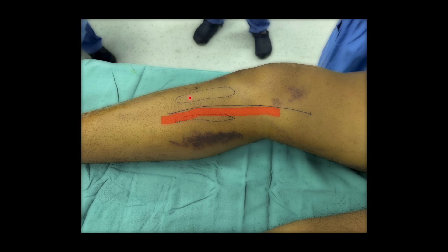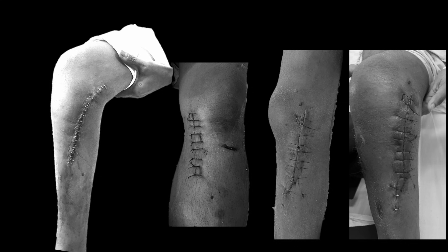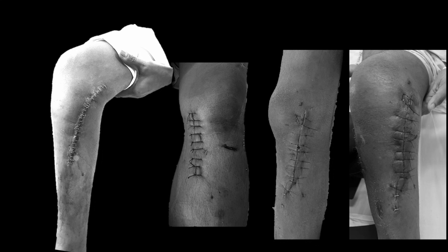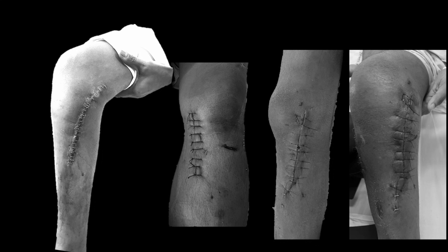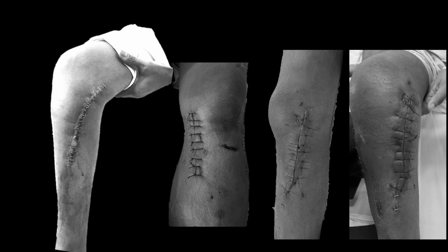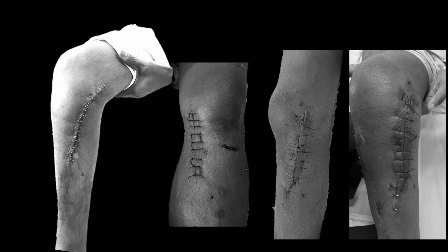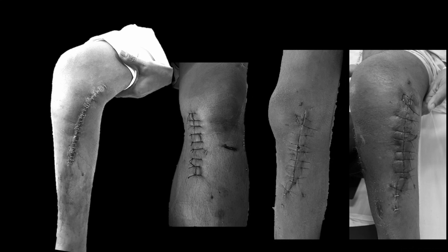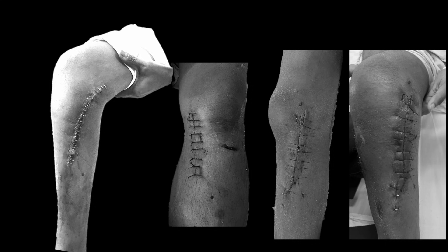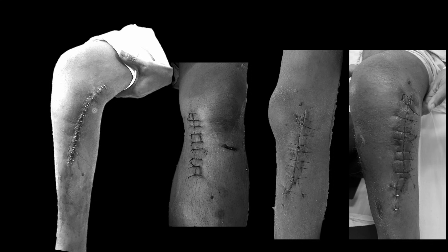Taking a good incision is not sufficient — you also have to choose a good wound closure modality. Many people use staplers in this area, but staplers create so many constrictions that you can experience marginal necrosis. Staplers also create a closed dead space, not allowing blood to escape. Ultimately the collected blood will come out later and the patient will complain of constant oozing on the medial side. You have to avoid staplers in this zone.